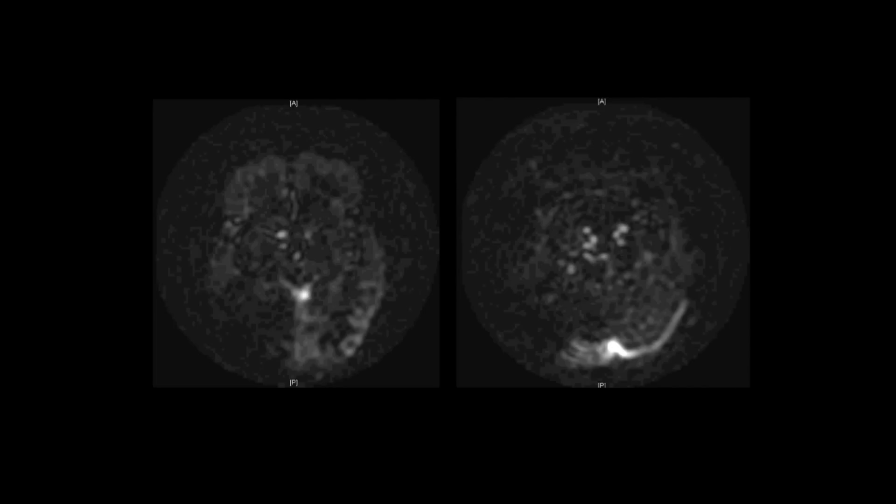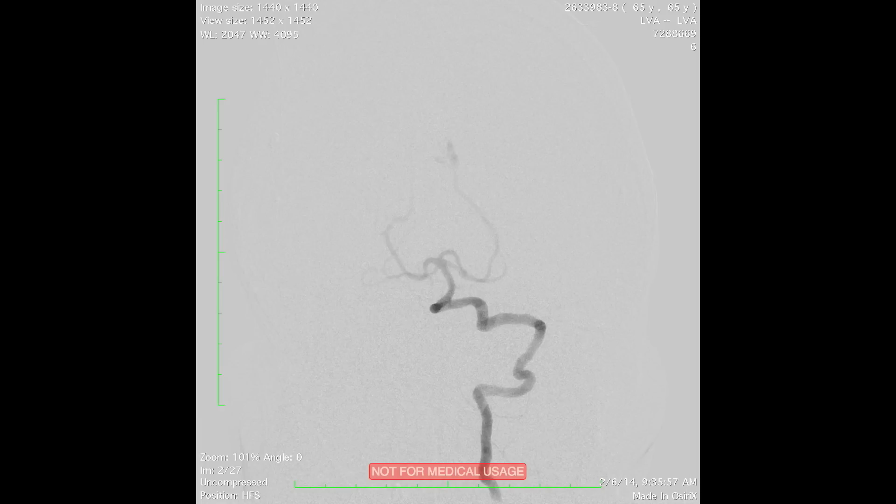We completed MRI imaging, and what you see is an axial ASL (arterial spin labeling) sequence where you can see bright signal near the galenic complex, the torcula, and the left transverse-sigmoid sinus, indicating arteriovenous shunting. Based on these features, we recommended the patient undergo a cerebral angiogram to characterize any fistulization.